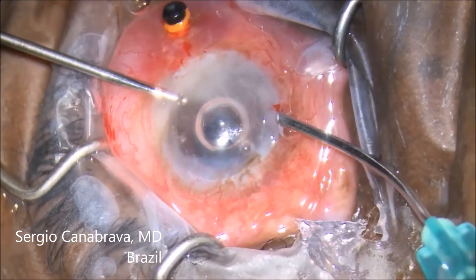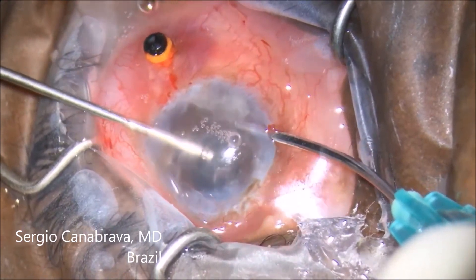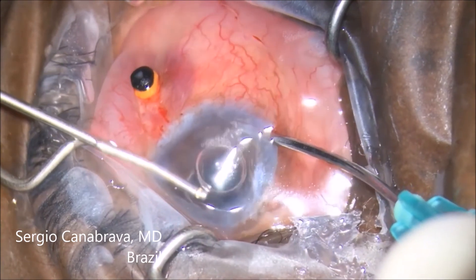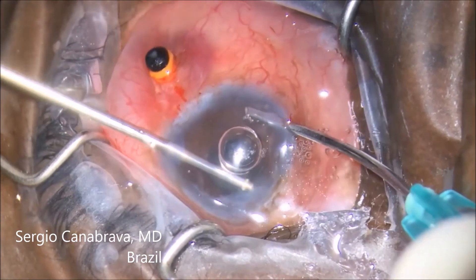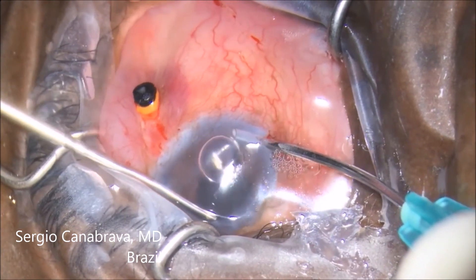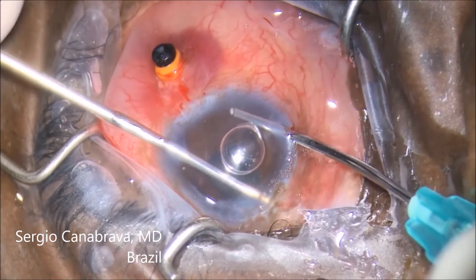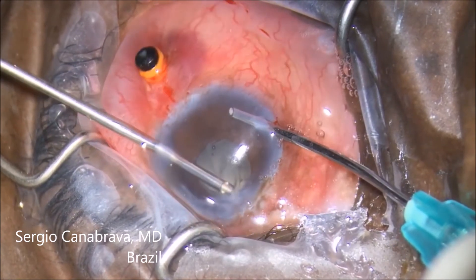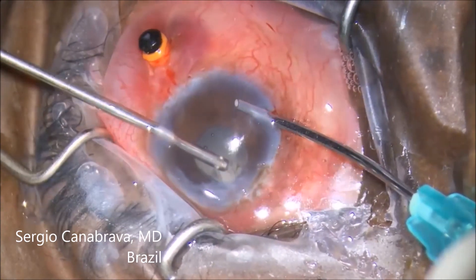This is a good anterior vitrectomy. I use triamcinolone to identify the vitreous. You can see how I go to the main incision — above the main incision — to cut the vitreous. You can see how the incisions are sealed and there is no vitreous in the incision.